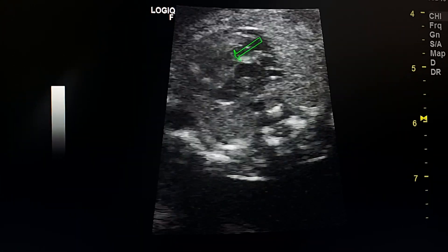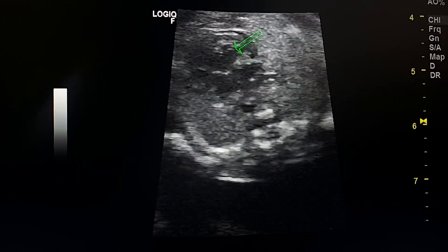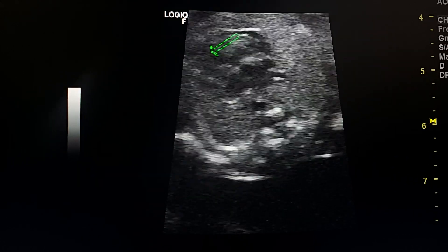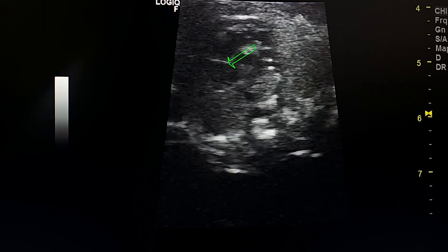This is the VSD. This is the small-sized right ventricle, and this is the normal-sized left ventricle. This is the mitral valve.